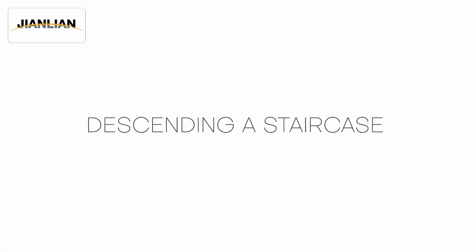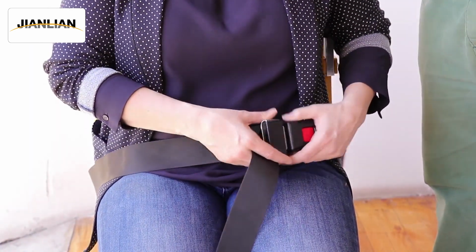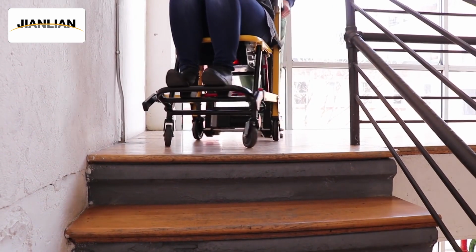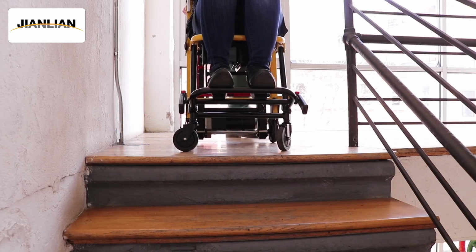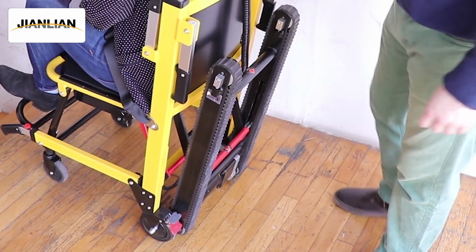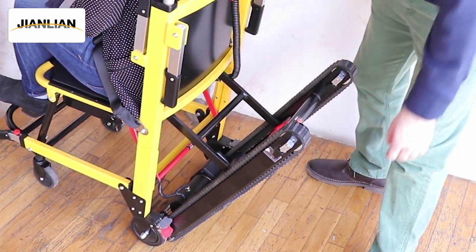To prepare to descend a staircase with the Mobile Stairlift, ensure the rider is securely strapped in with the safety belt and then approach the top of the stairs. Leave a few inches between the front wheels and the edge of the top stair. Lock the back wheels and push the top of the red track handle towards the arrow and pull the tracks away from the stairlift until they lock into place.